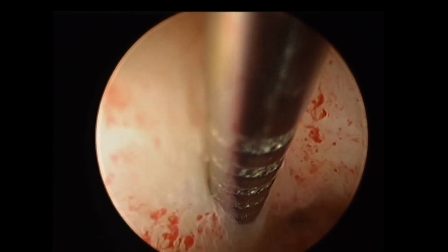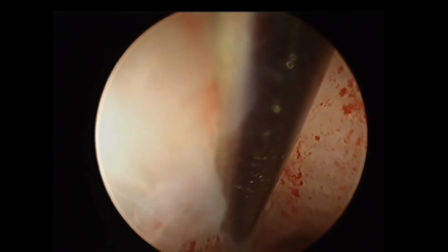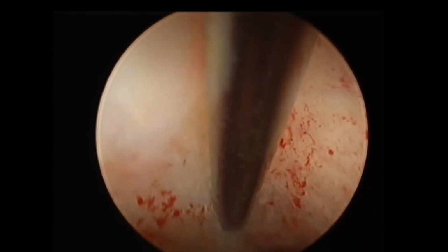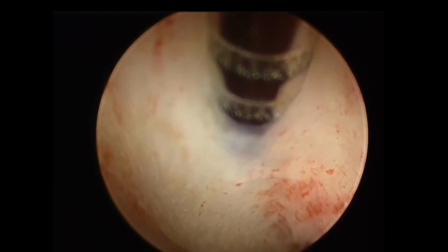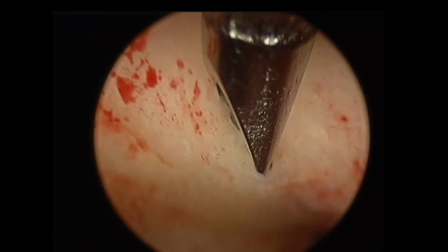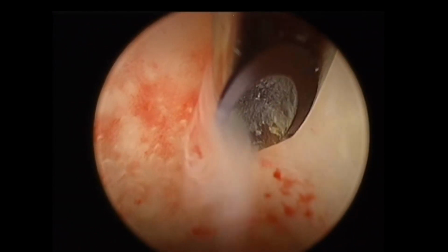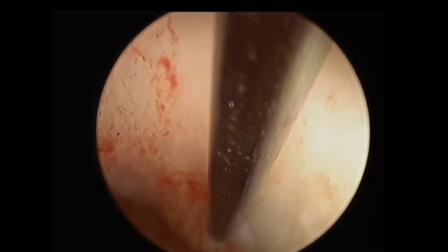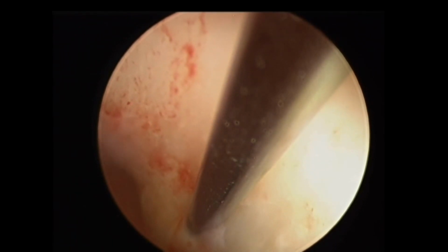Now, this is the needle for injection of PRP. It is the conventional ovum pickup needle that is used in IVF for oocyte retrieval. It goes through the operative channel. The diameter is the same, 5 French, so it can go very nicely and simply through the operative channel. And the technique that I developed some time ago, thank God, is working very well so far. The preliminary results are promising.